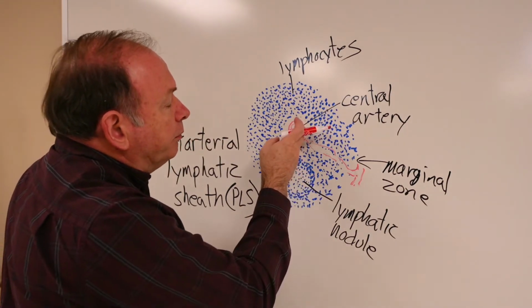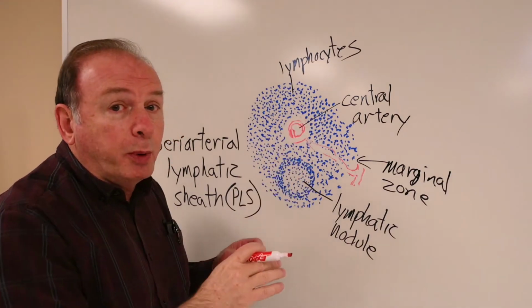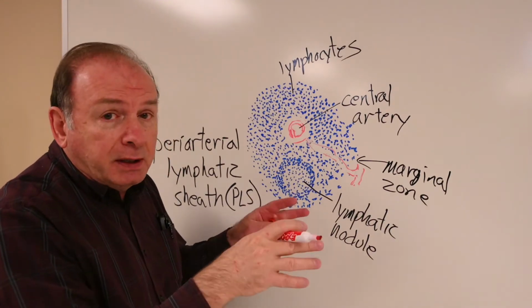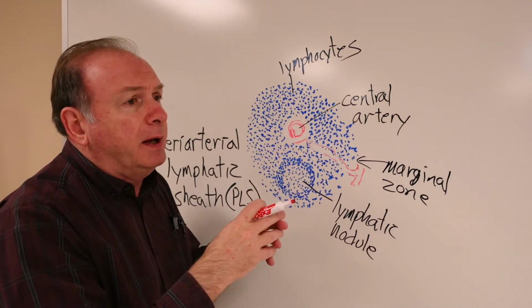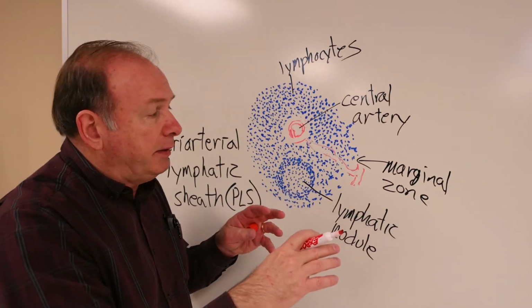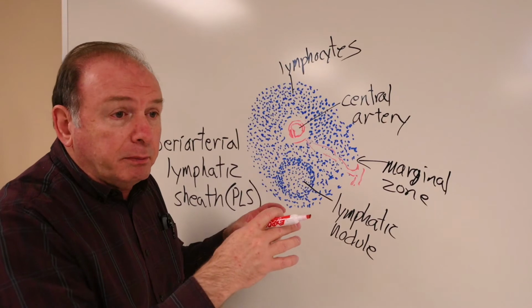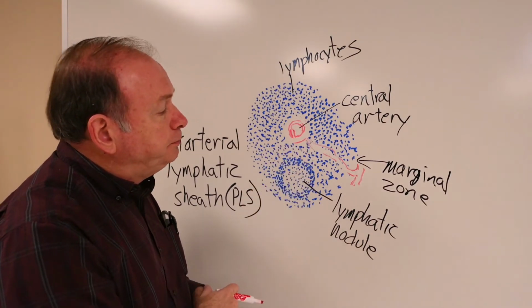But the spleen is better known for having the blood pass through the white pulp and then enter into those penicillar arterioles, then into capillaries. These capillaries are going to be sheathed with macrophage cells typically, and they call them sheathed capillaries, that terminate out there in the splenic cords beyond the white pulp into the red pulp.